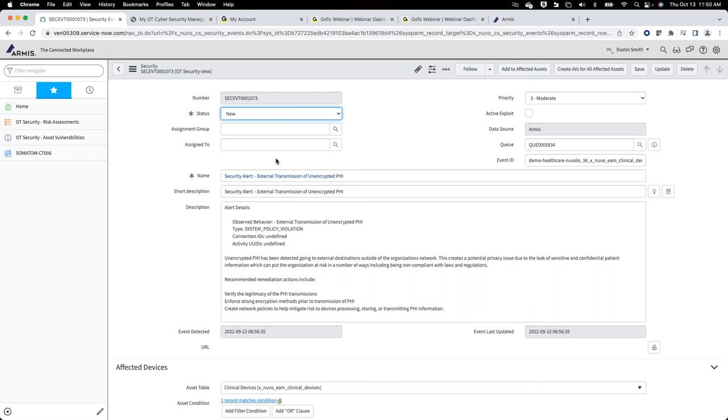Can I ask a question? For example, a device is already registered in the CMMS. Say a vendor device, a clone device, is now registered in the database and can be discovered by the system, but other devices may belong to the vendor and we haven't put them in the system yet. Can the system alert the people?